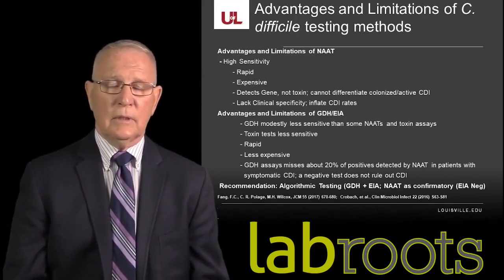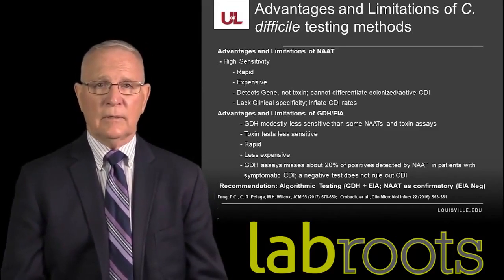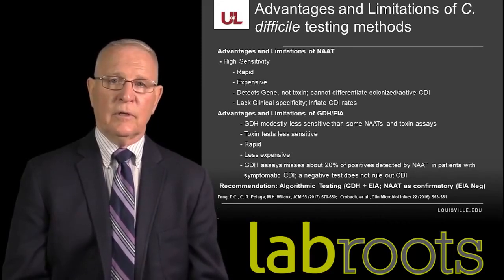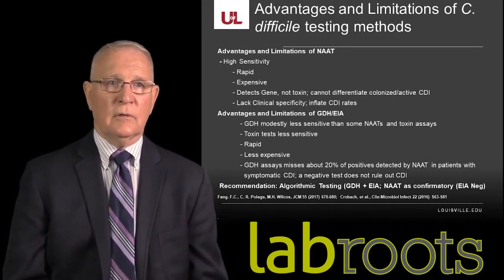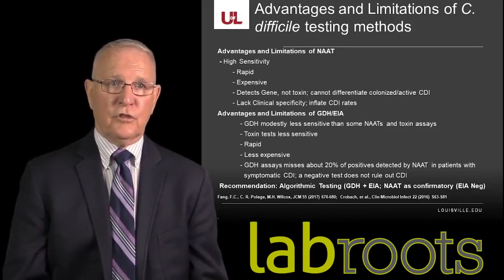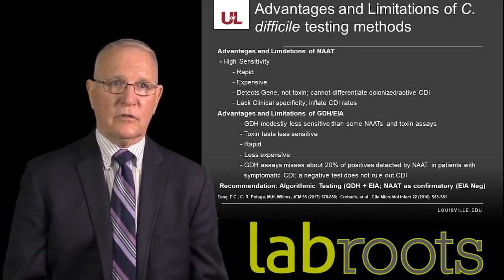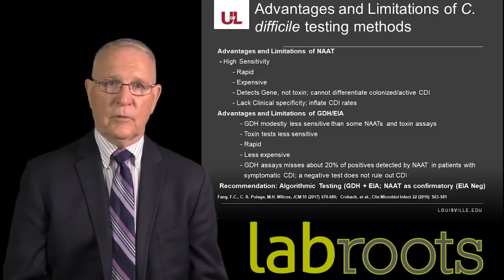But there are some positives to direct PCR as well. Before I get to those, keep in mind, molecular tests are expensive. They are not cheap. So we have to take that into consideration with regards to how we approach our C. difficile testing. To remind you once again, the molecular technologies, in this case, detect the gene that codes for the toxin but do not detect the toxin itself, and thus cannot differentiate colonization from active disease.